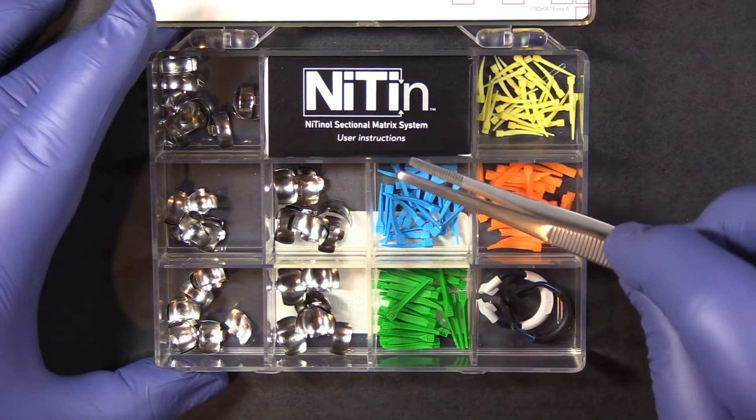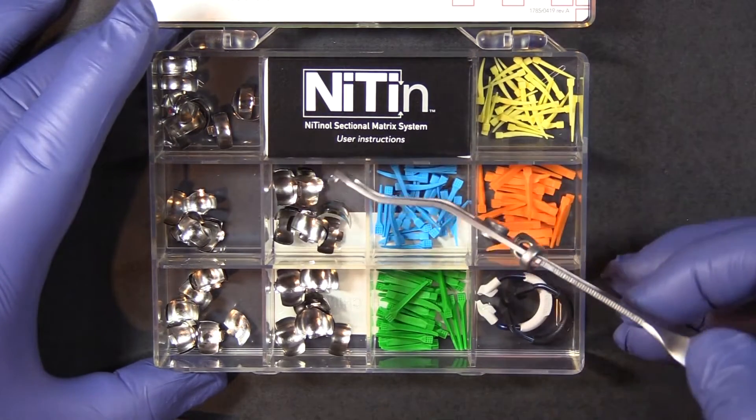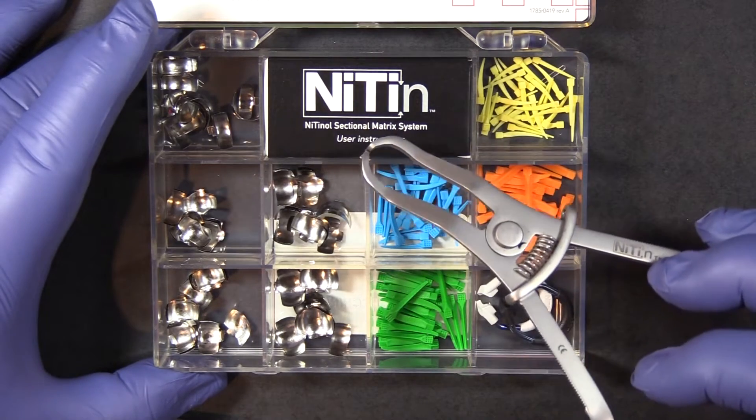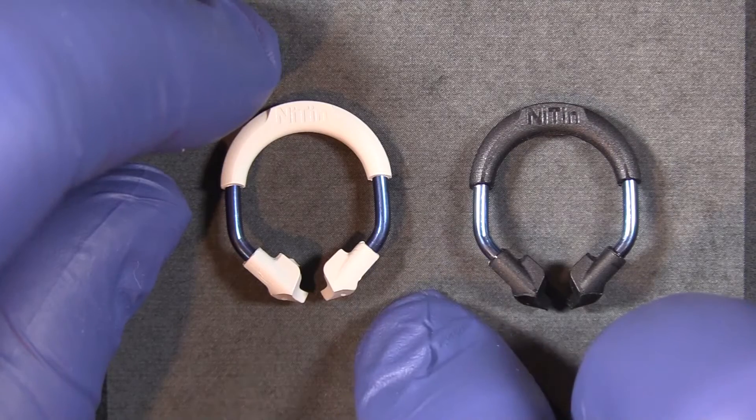Depending on the kit that you get, you may also have the band and wedge placement forceps and of course the sectional matrix placement forceps. It's very important that you use the appropriate forceps for the kit that you have.